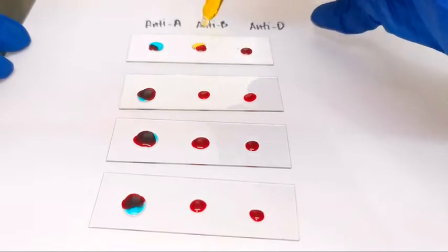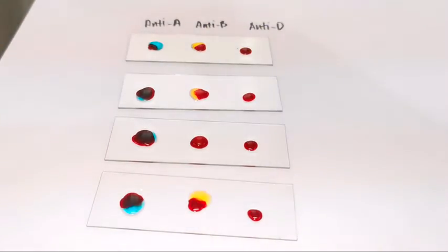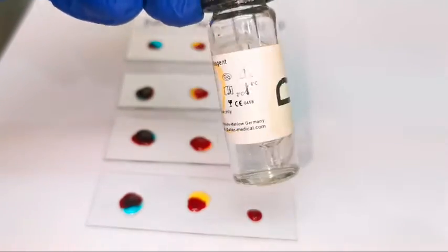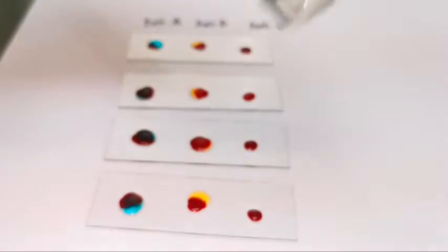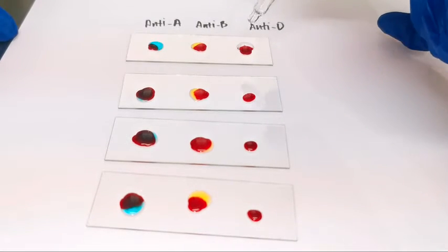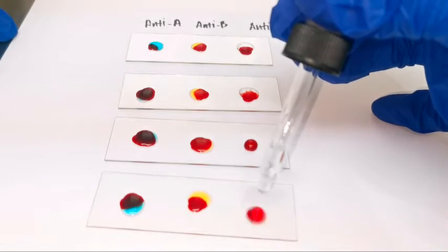Put 1 drop of anti-B antisera on the second column. Put 1 drop of anti-D antisera on the last column.